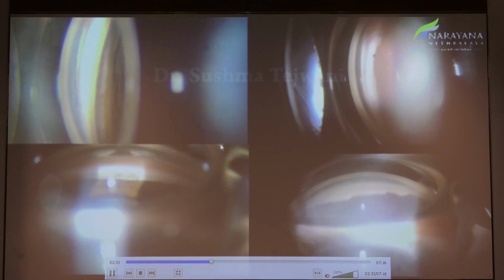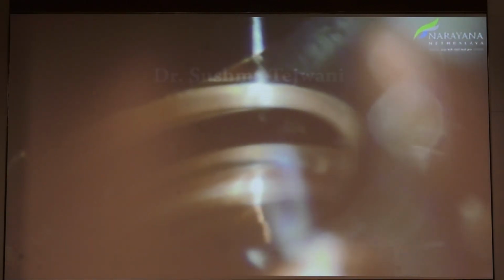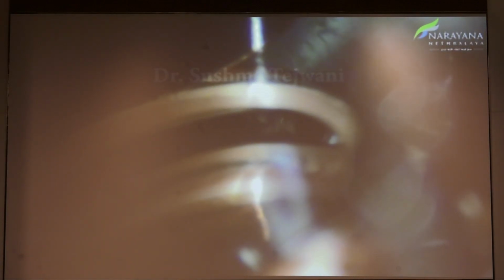Now these are all different examples of gonio angles, which I will explain. Now these are the structures that you can see. So this is an oblique illumination in the inferior angle that you see.